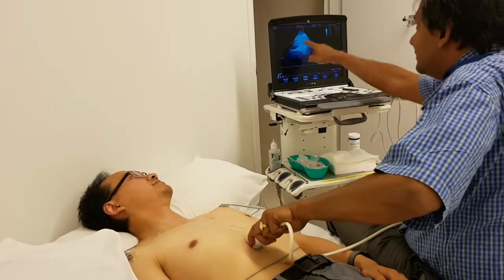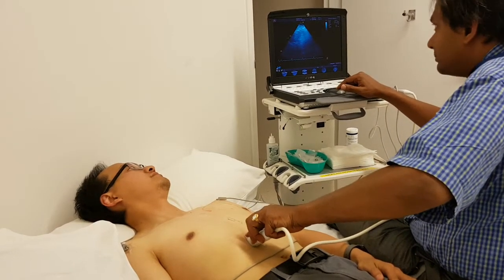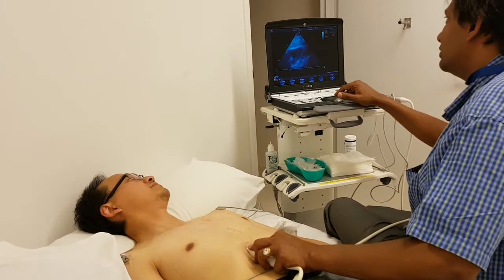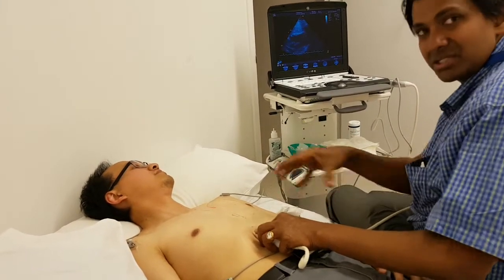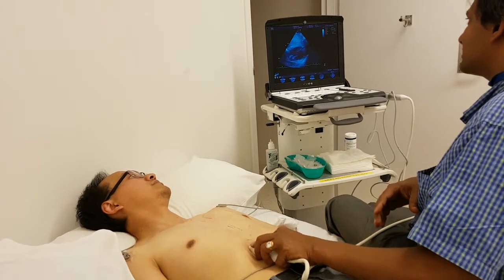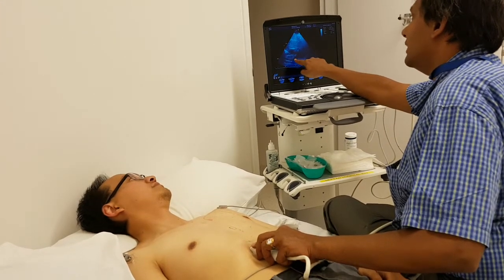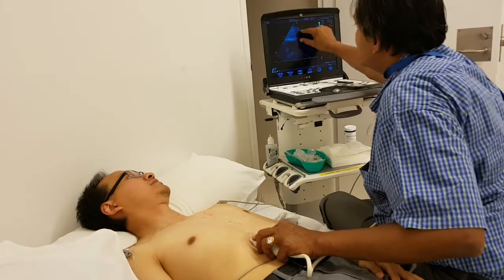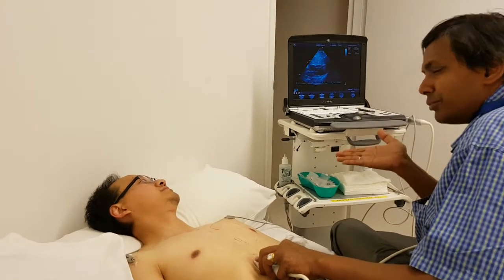Once again: right side, liver — get it perpendicular, get the liver. Then slowly start tilting the probe, dip under the sternum, and the heart should come into view. You can't do much movement here because you're stuck in that area, but you can rotate a little bit to make an oblique or coronal axis. That's the right ventricle, that's the left ventricle, that's the aortic valve. If you're getting the aortic valve — it's anterior — and you want the four-chamber view with the mitral valve, you have to tilt a little bit more posterior.